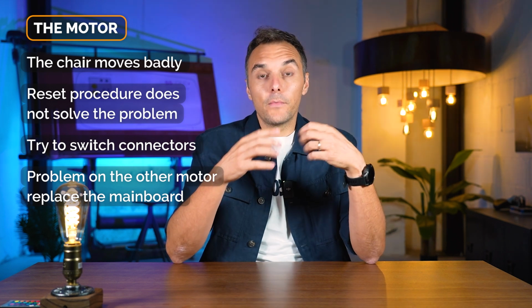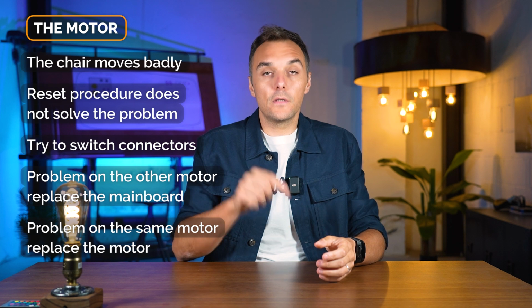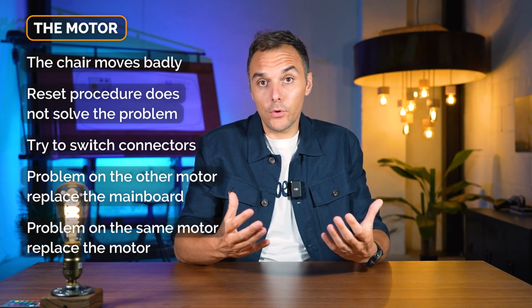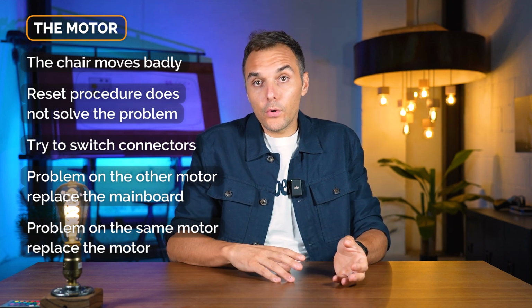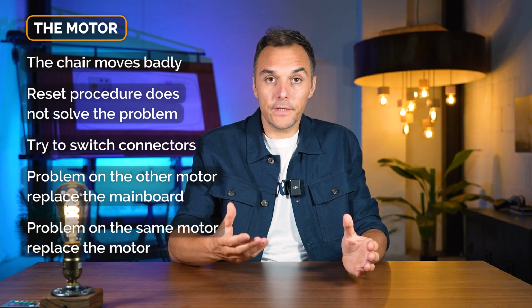In case the problem remains on the same motor, on the same movement, then the problem is in the motor itself. In this way we can easily identify where the problem is, whether it's the motor or the main board. In the case the problem is the main board, we can replace it. In case it's in the motor, we can also replace the motor.